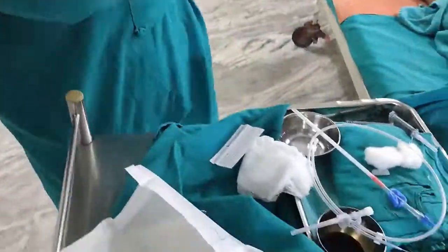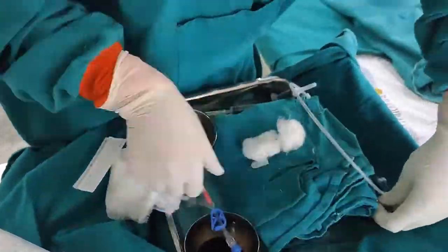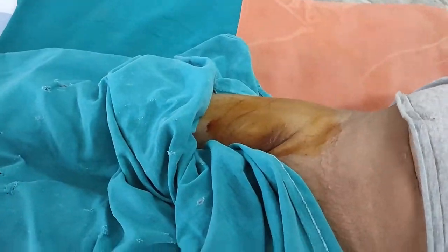Today we are going to learn how to insert a femoral cannula. First, I am going to paint the right femoral area.